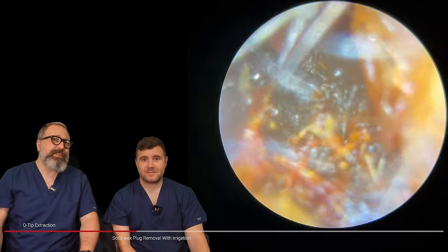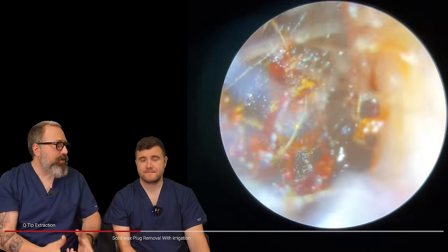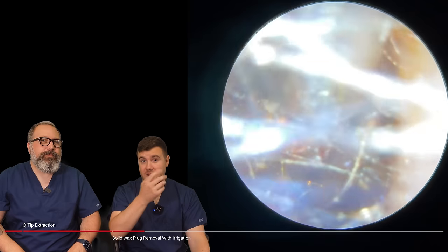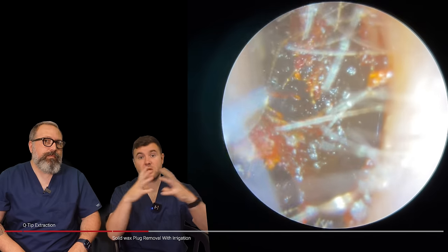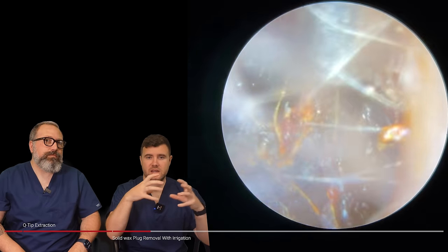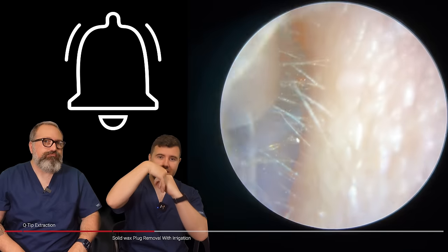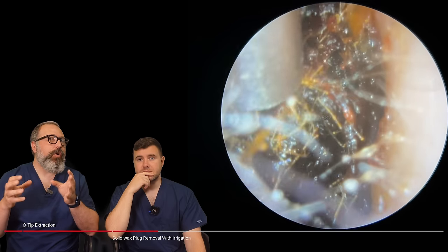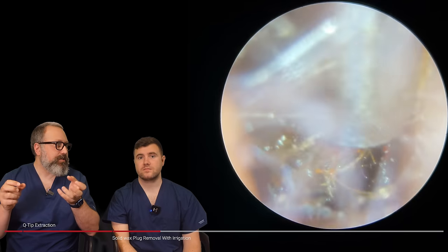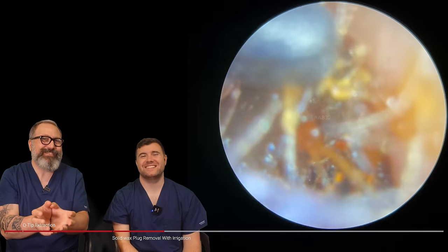Now this is a tough plug — it didn't look like it was going to be a hard one to do, but it is tough because it's quite long and quite sticky. It's not quite hard enough that the curettage tools can get behind it and pull it forwards, but it's a little bit too adhered to the canal wall for the suction tube to pull it out. If we talk about wax being the correct consistency being like the Goldilocks zone, this would be the opposite — the anti-Goldilocks zone. That consistency of wax where no tool is going to get this out — it's really evil stuff.